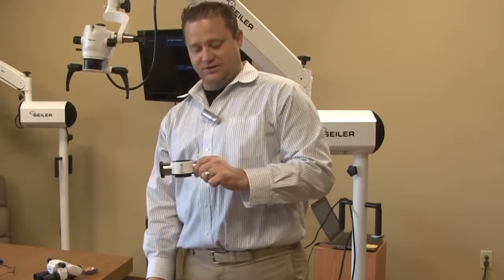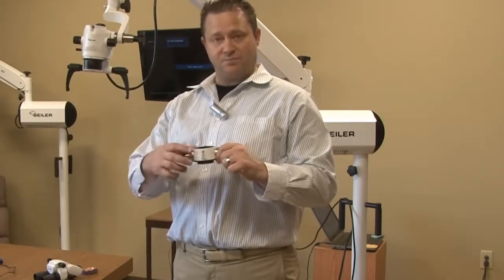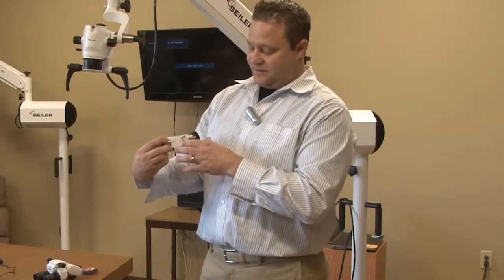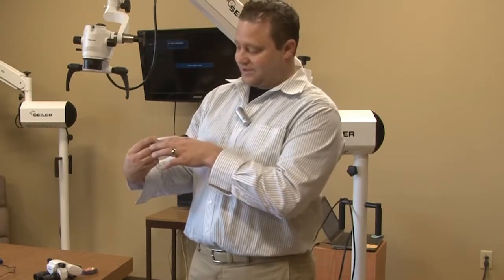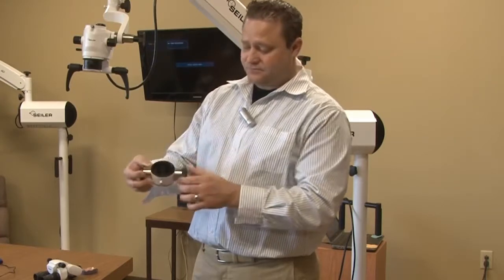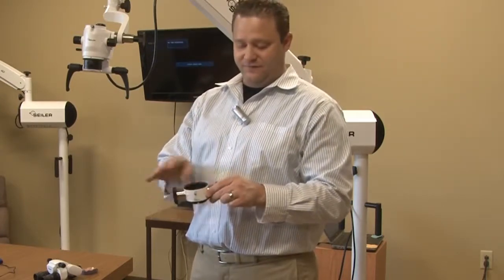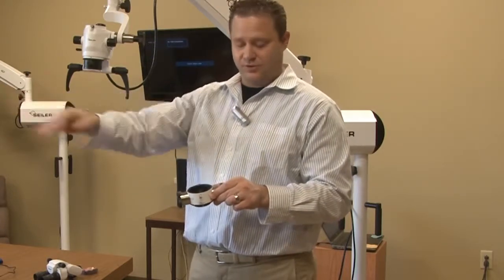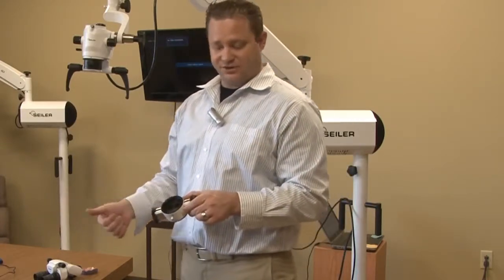After light hits the specimen, it's going to bounce back up into the beam splitter. Depending on which path you have the video or digital on, that's going to be the amount of light reflected into the right side or left side of the port. So for instance, if you have the 50-50, you have two optical paths going through the beam splitter — you're going to have 50% of the one optical path go through the port in order to give enough light to get the video or digital imaging.